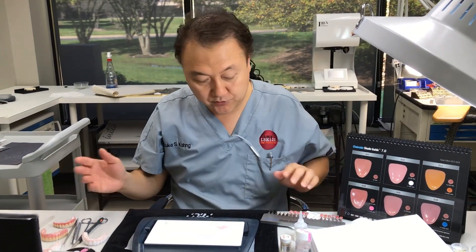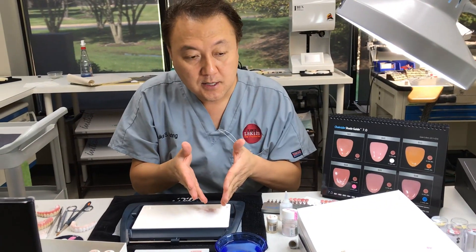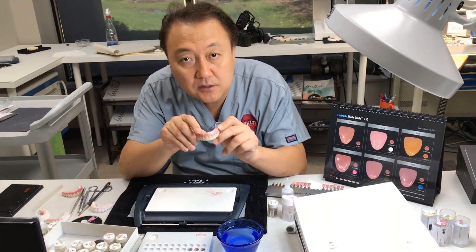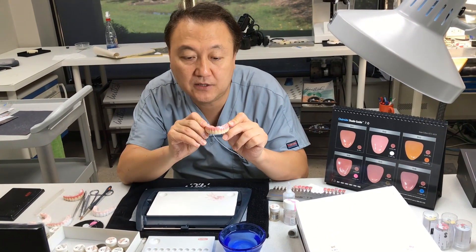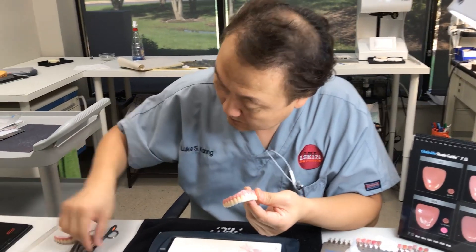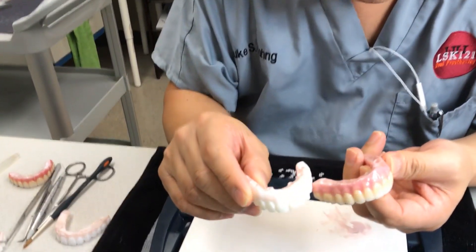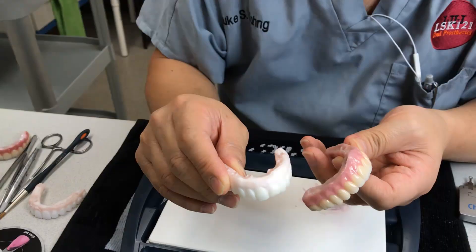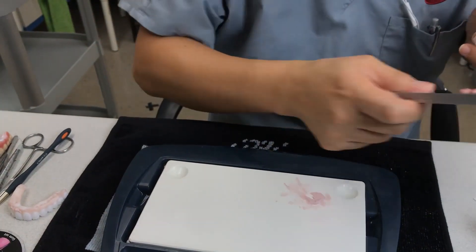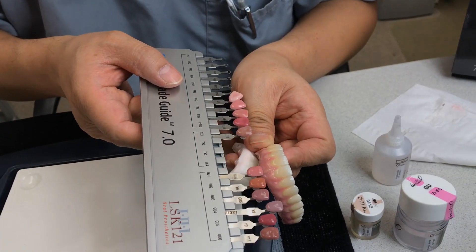So in the next chapters, I choose one color and then I create this kind of color — which is finer. From here to there. So you can see the color differentiation. Whenever you check the gum, this one is perfectly matched.